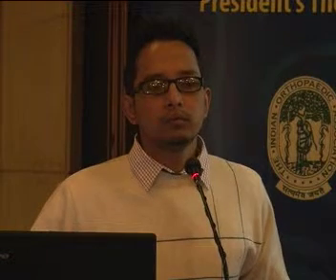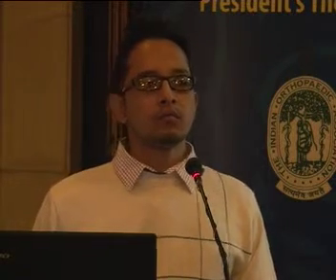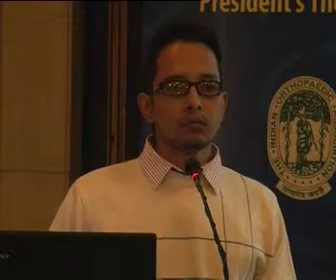Our target was that the total version, femoral version plus acetabular cup version, is 40 degrees. So if there is any problem of more than 25 degrees, then as sir said, we can adjust by femoral version. It's only a bailout option. It's not the perfect remedy or solution for that. It's only a bailout, somehow to get out of the procedure. Somehow you have to get out of the OT room. So it's only a bailout thing. The stem will not dislocate during different ranges of motion, but that particular patient might not have the complete range of motion. It's a bailout option.